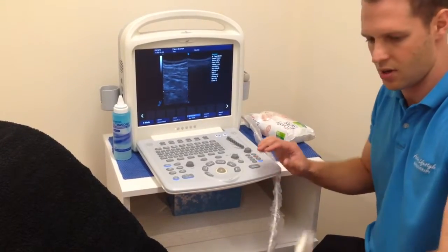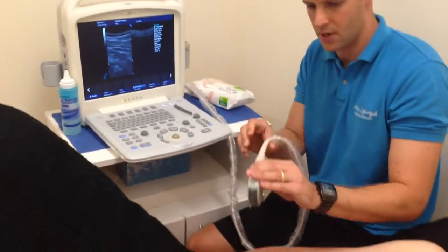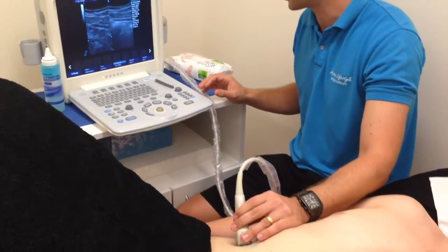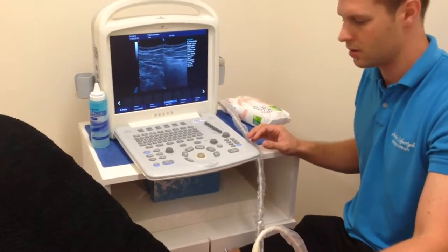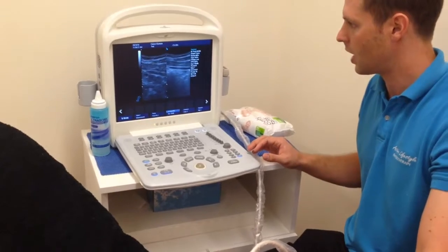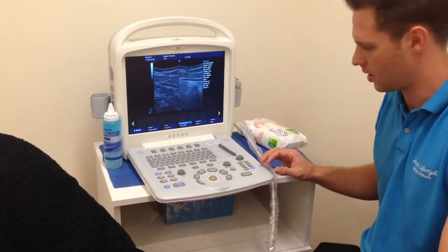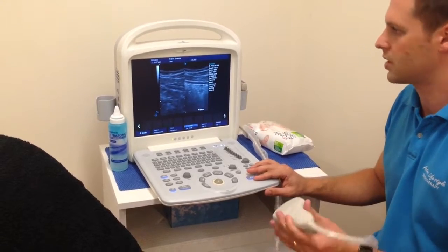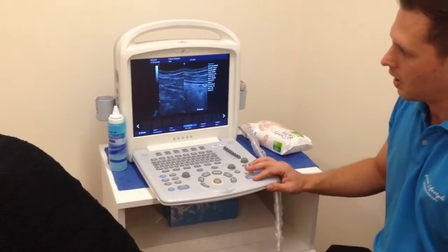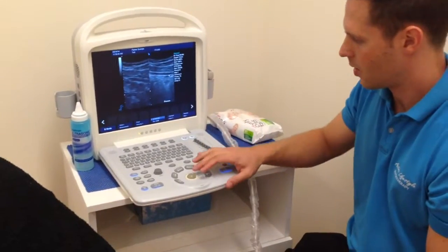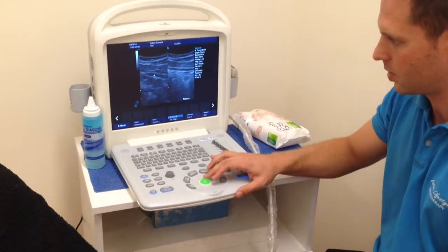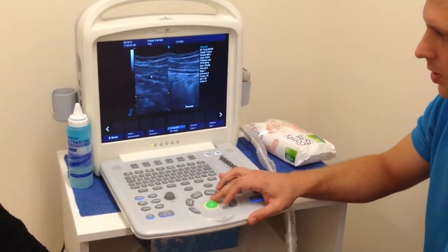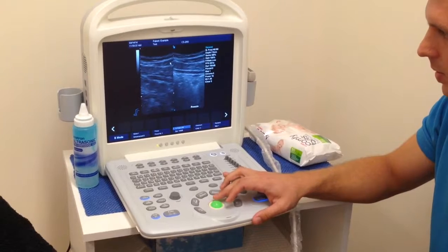Then we're going to come to the right side again, just flipping the probe around so that that point stays in the midline, so we're going to get exactly the same image. Just breathe in and out. And we freeze it there. In this mode, we can measure the difference in thickness of the transverse abdominus, internal oblique and external oblique.